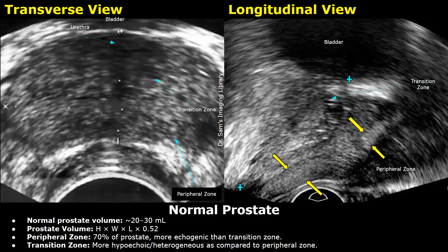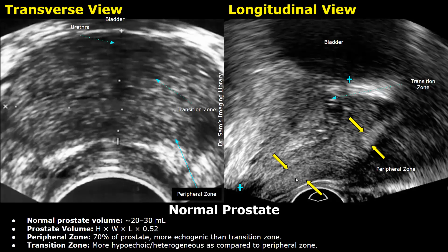This hypoechoic, almost anechoic linear region in the center is the urethra, and the transition zone is seen around it. This hypoechoic area is the bladder. In the longitudinal view on the right, this long echogenic structure is the peripheral zone, the transition zone is up here, and this is the bladder.